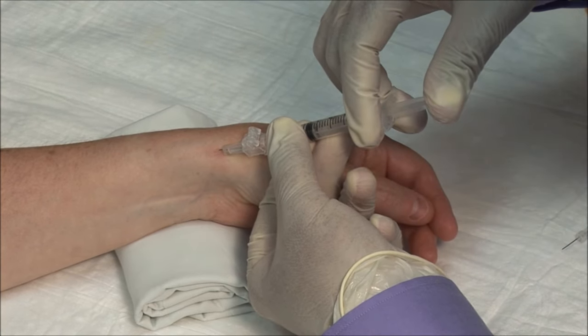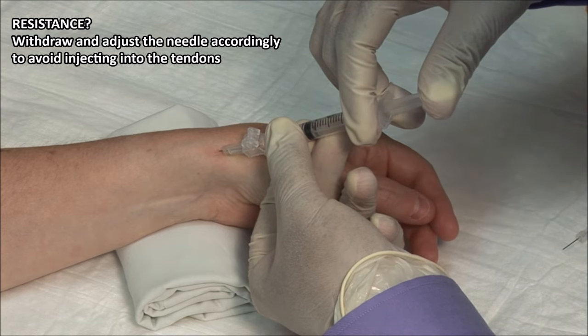It should go in freely. If you encounter any resistance, withdraw and adjust the needle accordingly.